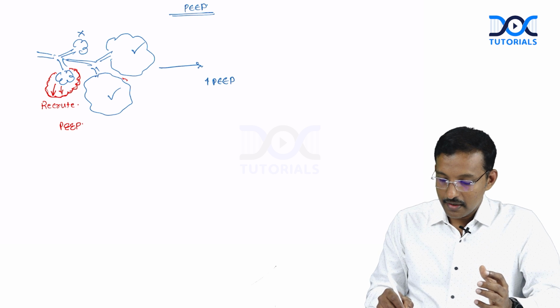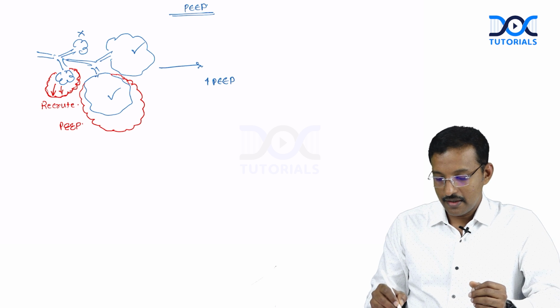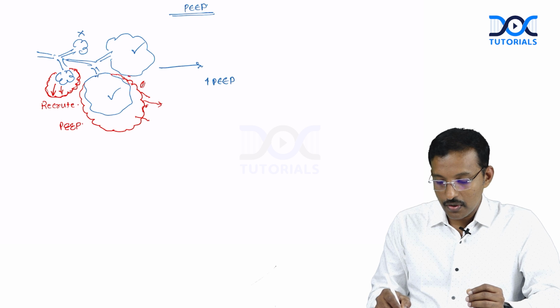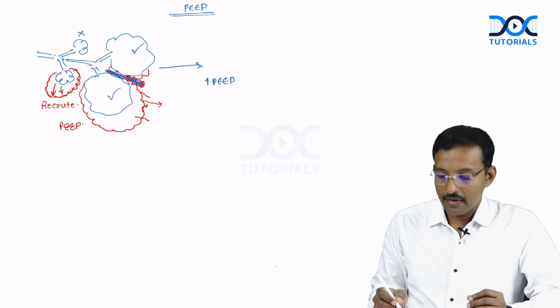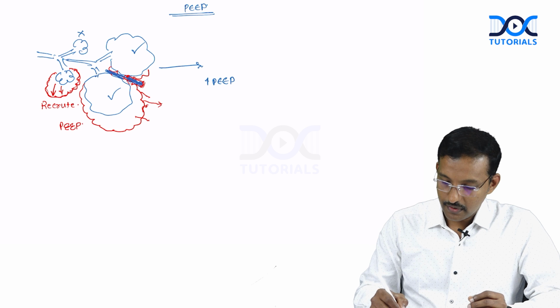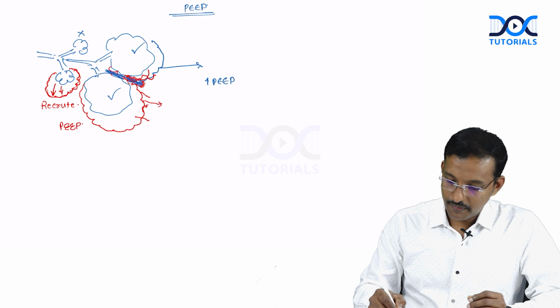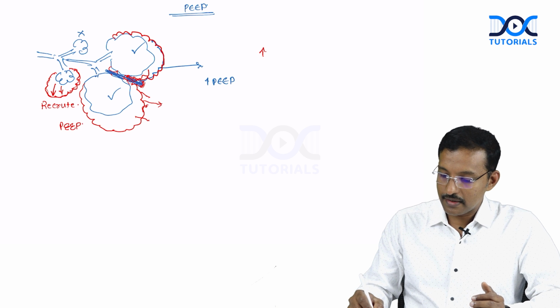At the same time, there is an overdistension of the alveoli which were actually taking part, and which can cause problems. This can cause a rupture of alveoli or a barotrauma of an alveolus. At the same time, it can also compress the blood vessels when the alveoli are expanding. So that is again another problem of increased PEEP. So PEEP is a double-edged sword.